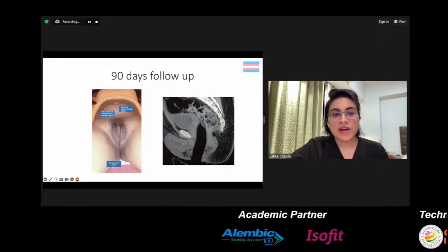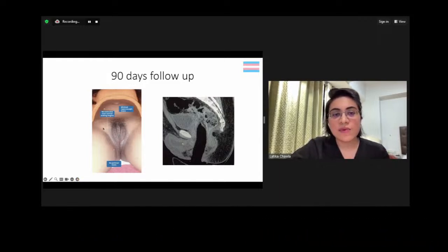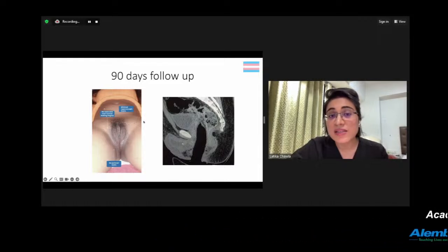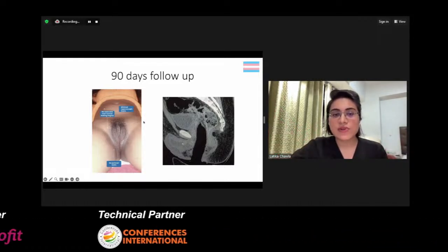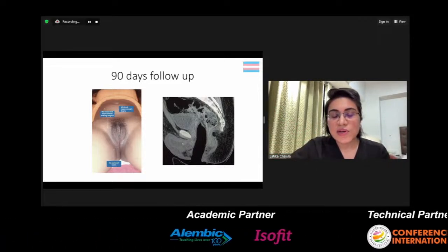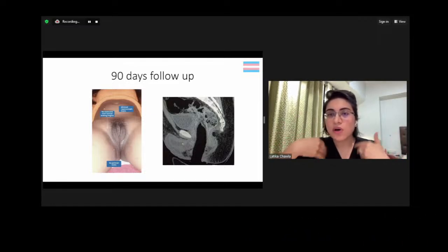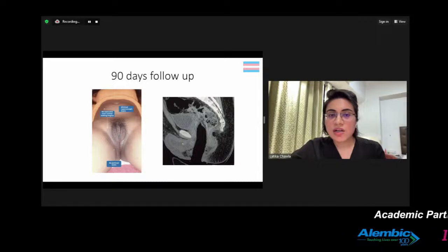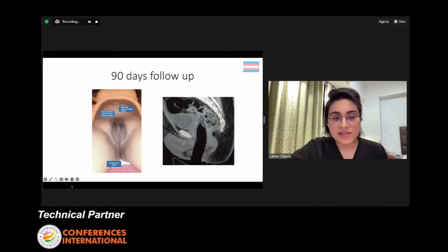The advantage here, like I said, is when you see that there are scars, usually when pedicle flaps are taken in the groin, large scars of 4 or 5 centimeters on each side. And as you can see here, because we have completely extraperitonealized, gone behind the bladder and pedicle, and used the flap internally, we have not come out anywhere, and it gives very good aesthetics to the patient.